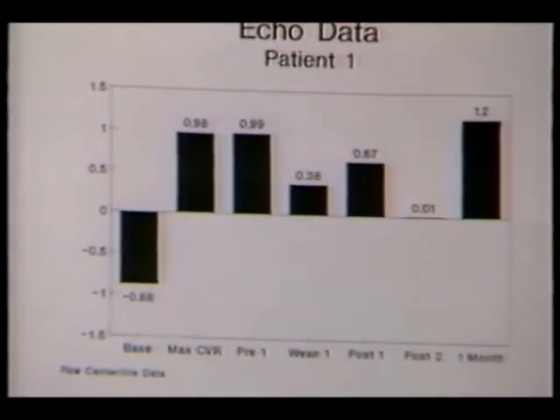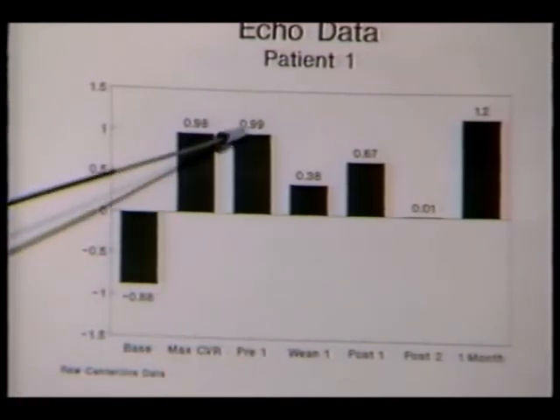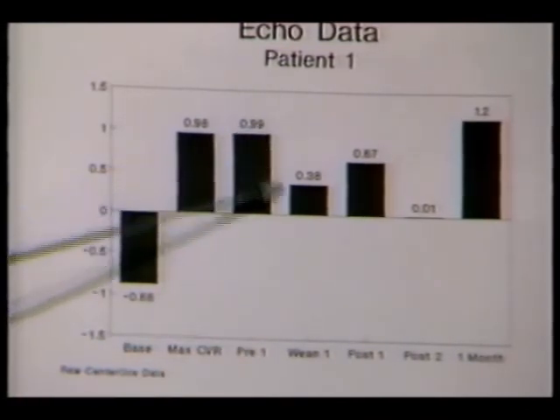The echo data can be seen in that he began with dyskinesis as analyzed by a centerline method and progressed to good systolic wall motion on maximum retroperfusion. Prior to the first wean, he continued with good systolic function, but with pain and ST change had a significant reduction in systolic wall motion.